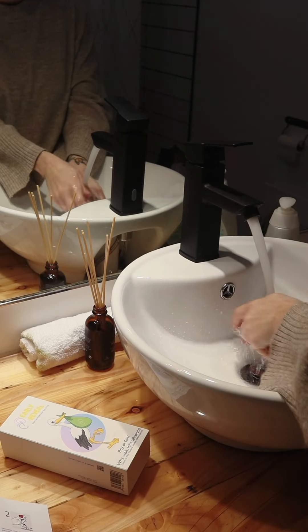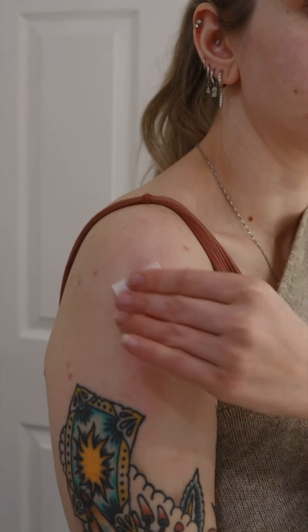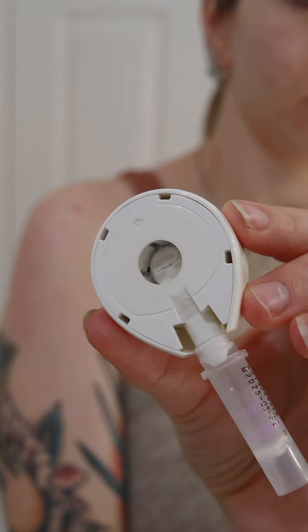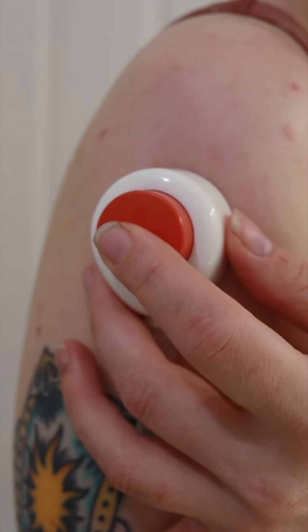Wash your hands again and then clean the area on the shoulder with another alcohol pad. Remove the strip and, keeping your arm along your body, place the device on the shoulder. Once the device is properly in place, press the red button firmly and release.